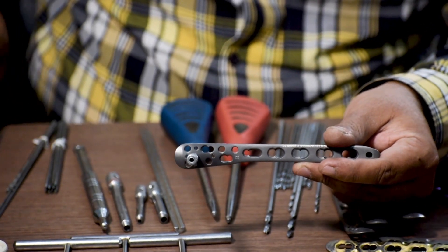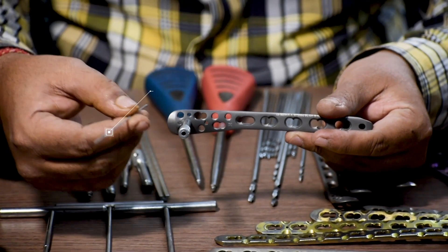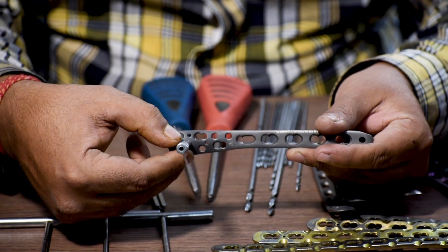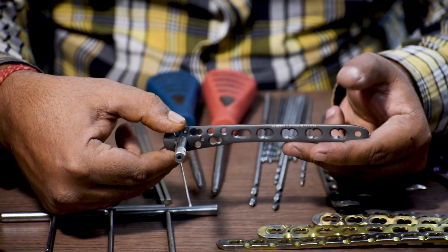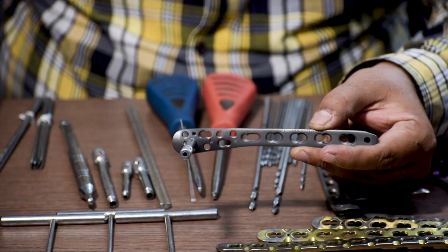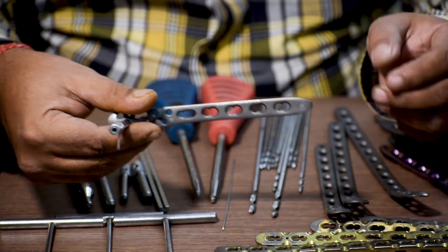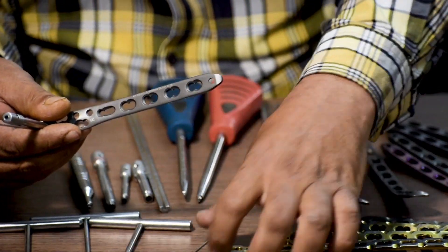After placing this plate in the fracture site, we will put a K-wire in this small hole so that it keeps the plate stable and the plate does not move during fixation. If the stability is not up to satisfaction, put another K-wire in this hole for further stability of the plate in the fracture site.